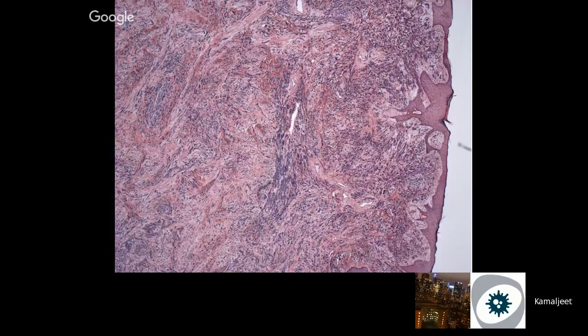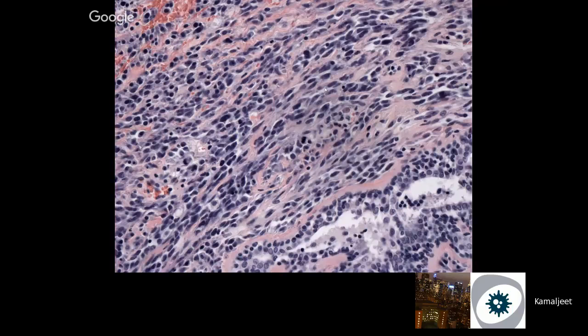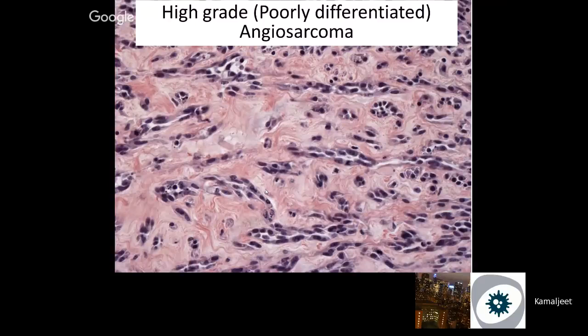This is another example, a high-grade angiosarcoma after radiation, and this is overt. It's involving the subareolar region. You can see the almost spindled proliferation, dissecting and involving the entire dermis. The key here is nuclear atypia. They can look epithelioid or spindled. They are forming vague sinusoidal structures. There are mitoses. It's malignant, extending up to the dermis, diffusely involving the periductal tissue. The diagnosis will rest on immunostains. You'll have to stain it and prove it's endothelial, with CD34, CD31, ERG, to call it a high-grade angiosarcoma.